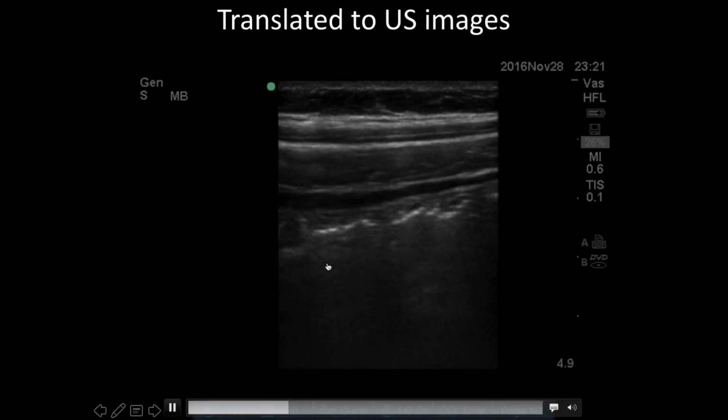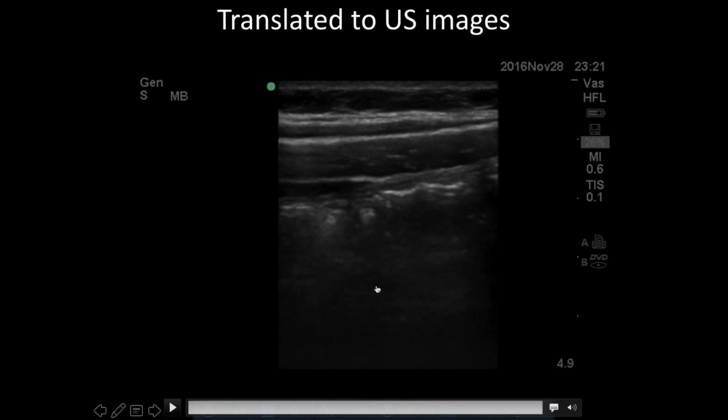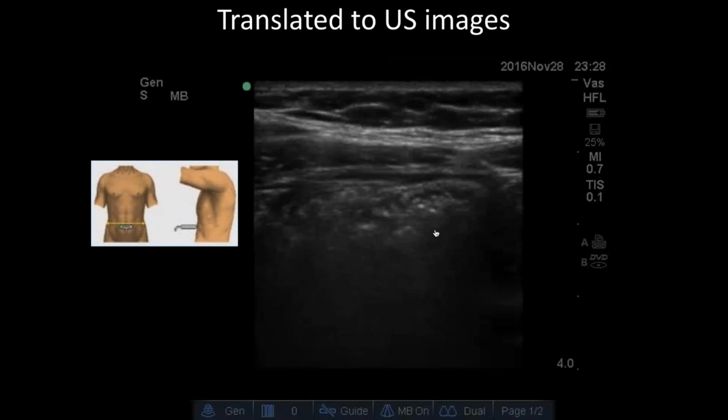You'll see underneath these areas of hyperechoic bright white lines that it's air, so you're going to get some dirty shadowing that comes down. And that can sometimes obscure good views of things. So one of the things that I'll emphasize during these ultrasound scans, and again at the end, is how we have to always utilize a good amount of compression, so graded compression as we do these scans.